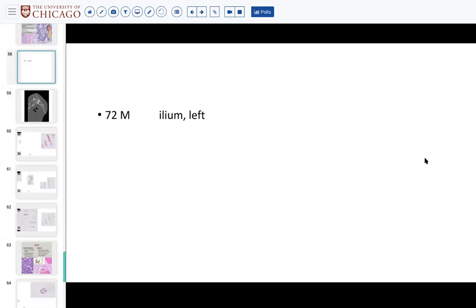I think Mayo, when we don't have any immunostains here, we generally send them out to Mayo for tech only. So they perform the stain, they send it back to us and we reinterpret it. So if there's ever any stains we don't have that we need, that's a pretty good way, including brachyury.